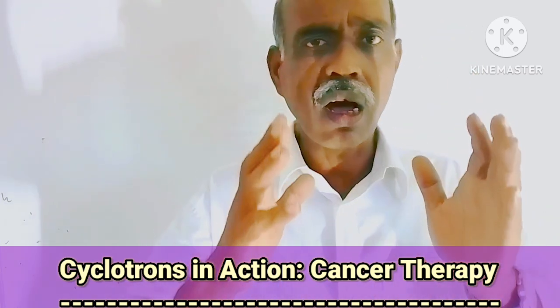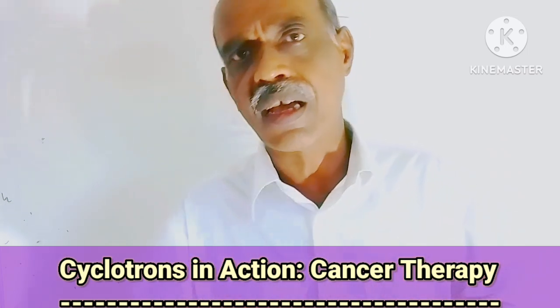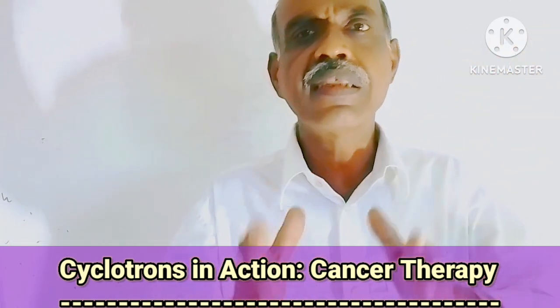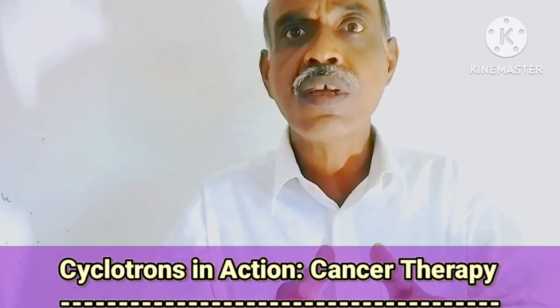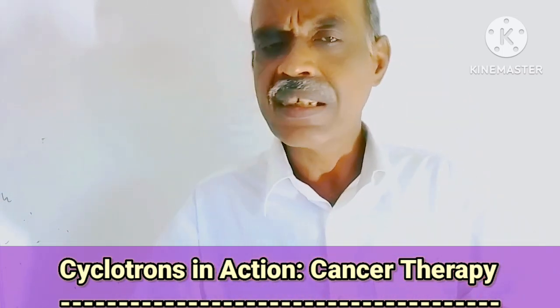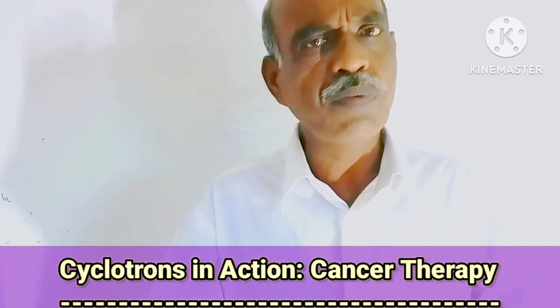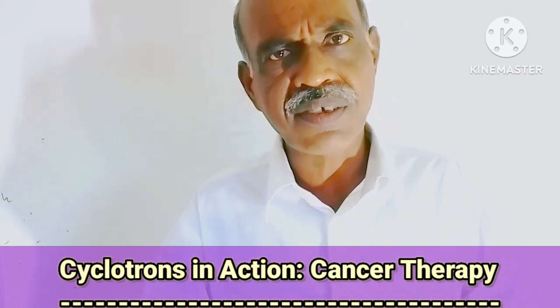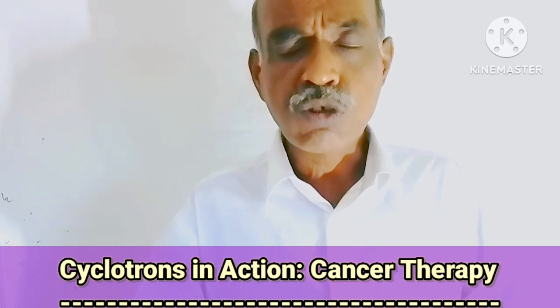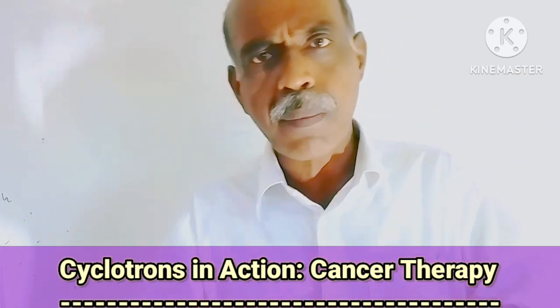Protons, or charged particles, deliver their maximum energy when they reach their target. And here the target is what? In cancer therapy, these are cancer cells, meaning tumors. So the property is known as the Bragg peak.